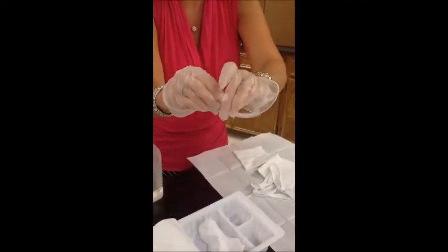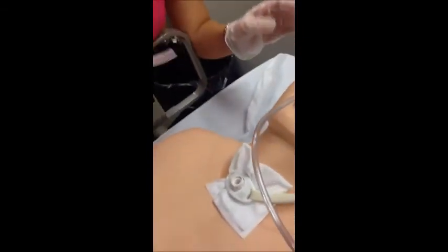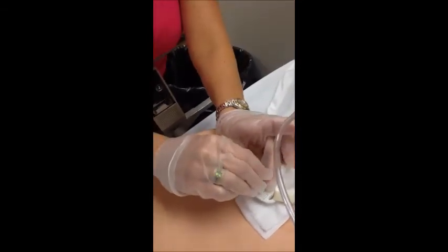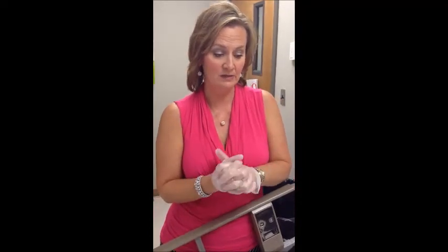Okay, now I'm going to come back and I'm going to put this into my patient. Oxygen's up. And this is weird, I know, but it goes in this way, I promise. And then you twist it and it slides down into the trach itself. And then I'm going to hold again and lock it in place. At this point, you can take a really good deep breath because the sterile part is over. Whew, hallelujah. But I still have a little more work to do.